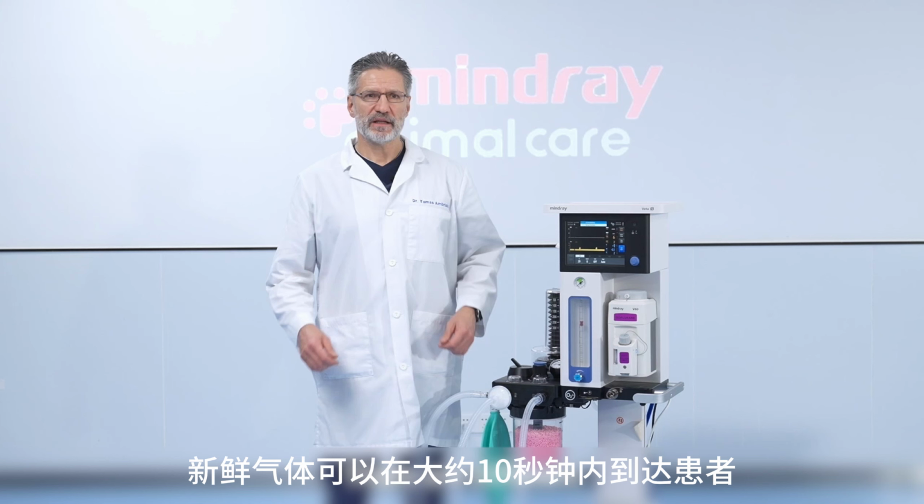In this situation, the lag time will be the 500 milliliter volume divided by 100 milliliter per minute equals 5 minutes. It means that whatever changes you make on the vaporizer, the new fresh gas will reach the cat 5 minutes later. This is a rather long response time in case your patient has an anesthetic emergency.